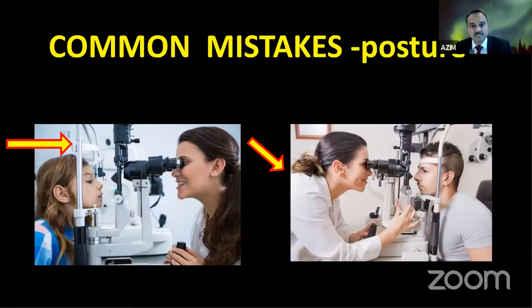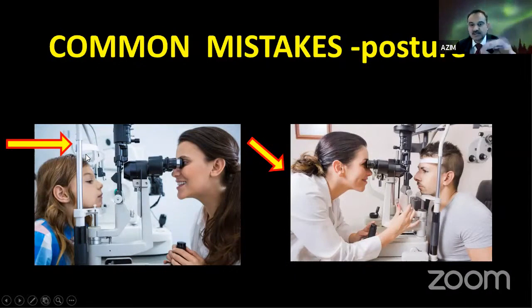Now for common mistakes, what you should not do. Look here. Here the patient is not keeping the forehead against the rest. I told you the most important thing which will make your life very easy: this, and this. Make sure your chair is adjusted and the patient is comfortable. Your life is very easy. You can get a very good examination very easily.